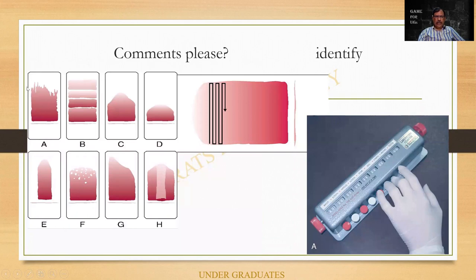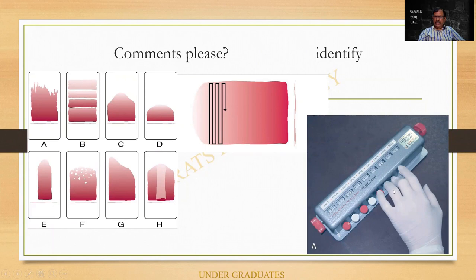Comments on smear quality: I find this has a very ragged edge — not a very good smear; these are all broken. Maybe the technician was not very deliberate in making the smear. These are the droplets I mentioned earlier. This is somewhat irregular in outline and this again has a break. This one is more or less tongue-shaped — ideal. And this is an exaggerated battlement method of doing a differential count. This is a differential counter that can be used for counting.